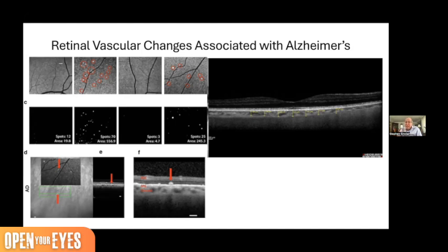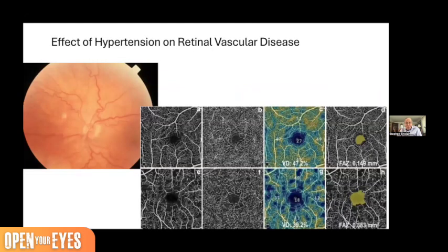Yes. And it's going to require not just the physician looking, but all these different imaging modalities improving and the AI assessment of that. Because what I'm trying to show is that a lot of the times when we look at pictures, such as this picture of this eye with hypertension, I mean, look at the blood vessel abnormalities.